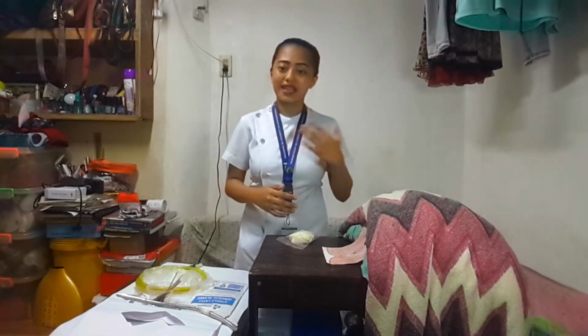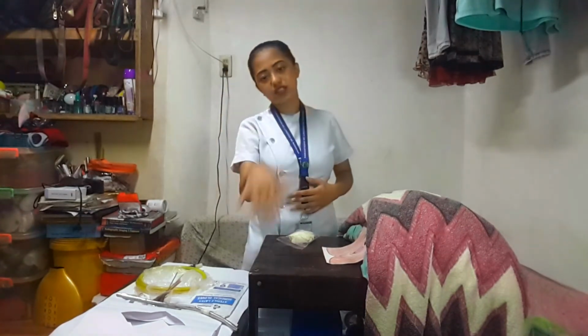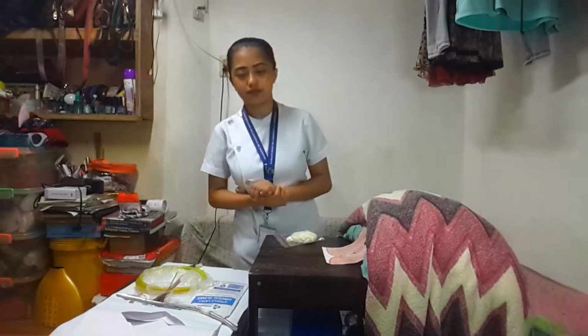Next, we need to raise the bed to an appropriate working height so that we will not be hassled in doing the procedure. Next, we need to stand on the client's right side if we are right-handed, and vice versa, the left side of the client if we are left-handed. I am right-handed, that's why I am here at the right side of the patient.